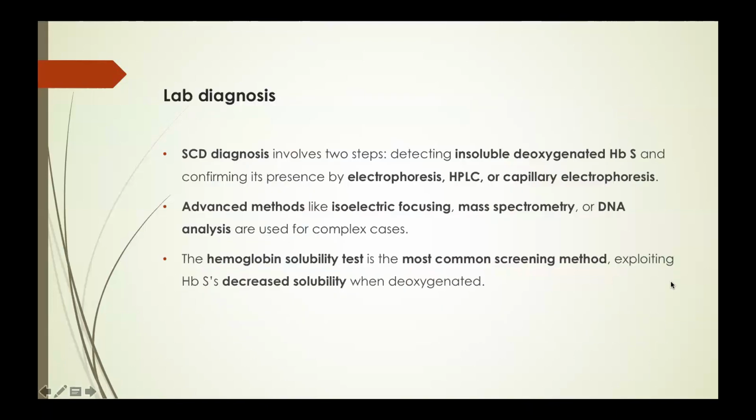Right. So for us to make a complete diagnosis of sickle cell disease, we can perform solubility testing, electrophoresis, high performance liquid chromatography, and also capillary electrophoresis.